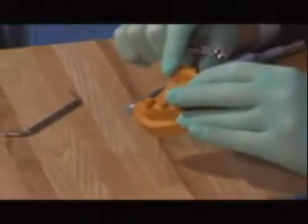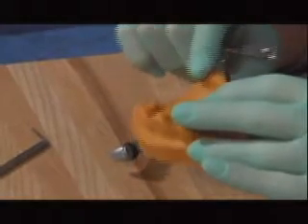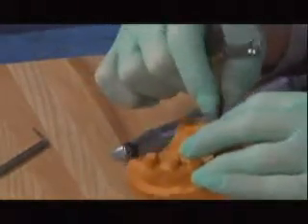that we have good angulation for this dental implant. It's not too much to the buccal, lingual, mesial, or distal. It's straight up and down. The implant's in a good place for restoring. At this point, we would remove the torque wrench.